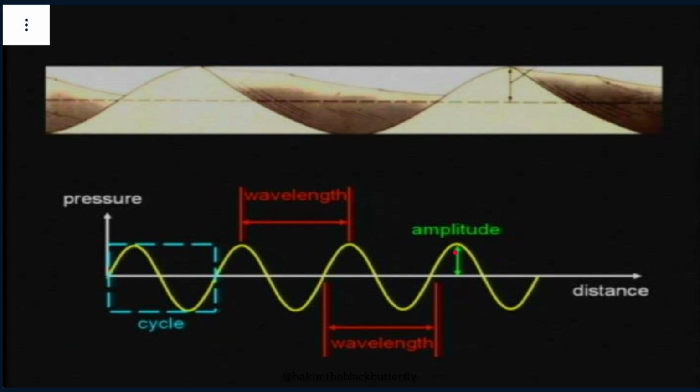Some highlights on how low frequency brings penetration. I've told you that at a higher frequency, molecules are vibrating so fast they are rubbing each other. Instead of transferring energy, they are converting it into heat. So at higher frequency, the energy does not go far. The beam doesn't penetrate far. The vice versa is true. At low frequency, the molecules are not converting energy into heat that much, so the beam can go far.